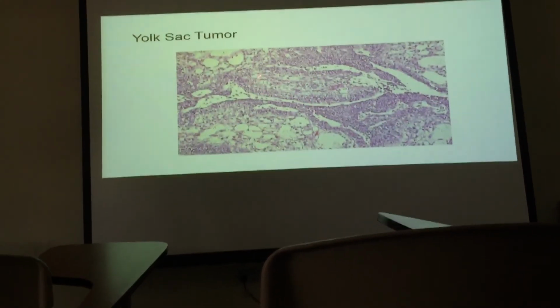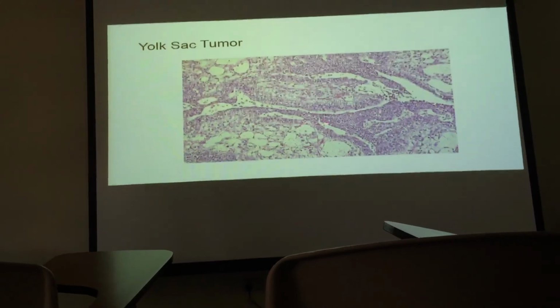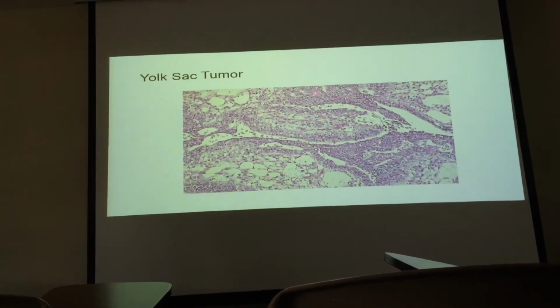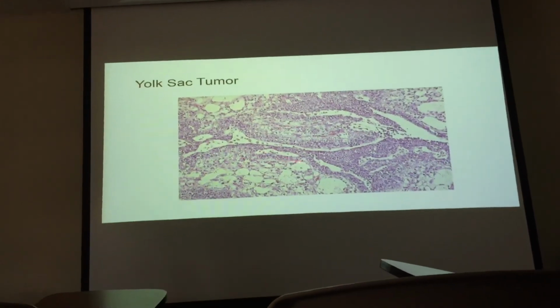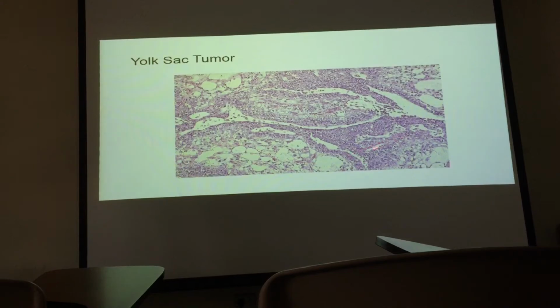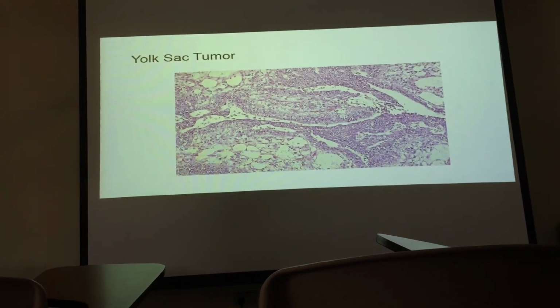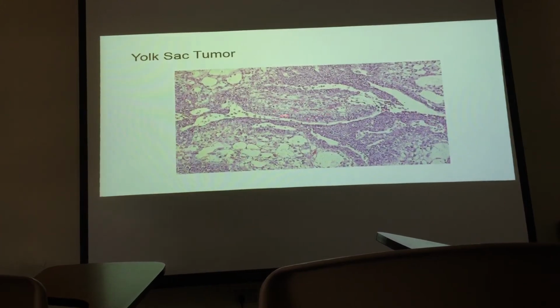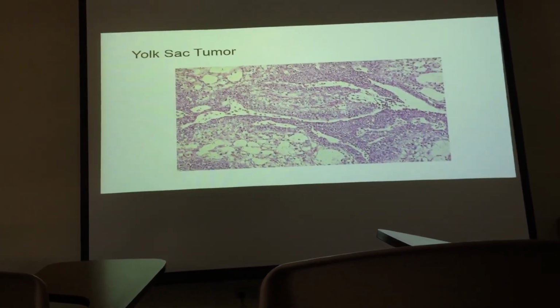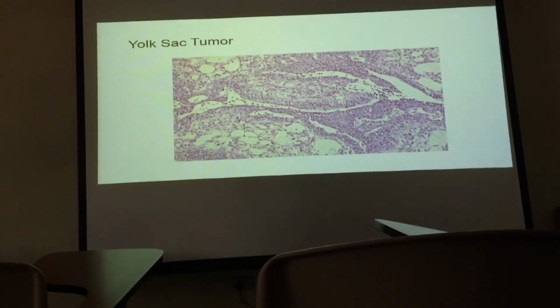These glomerulus-like structures are seen at high power, and these are small cells. They are forming pods or net-like patterns, a reticulate pattern, which is the proper word for it. But in my lecture slide, we have a good image of these glomerulus-like bodies. You will be having some clue with the image.